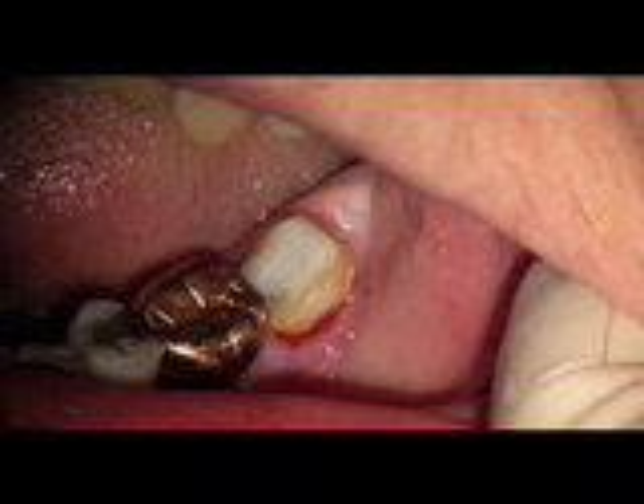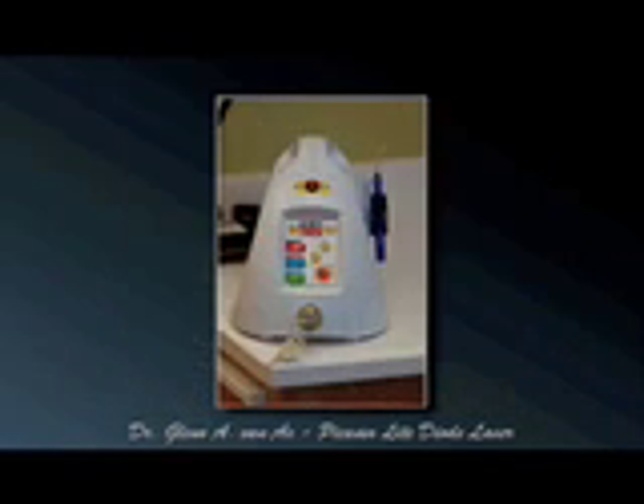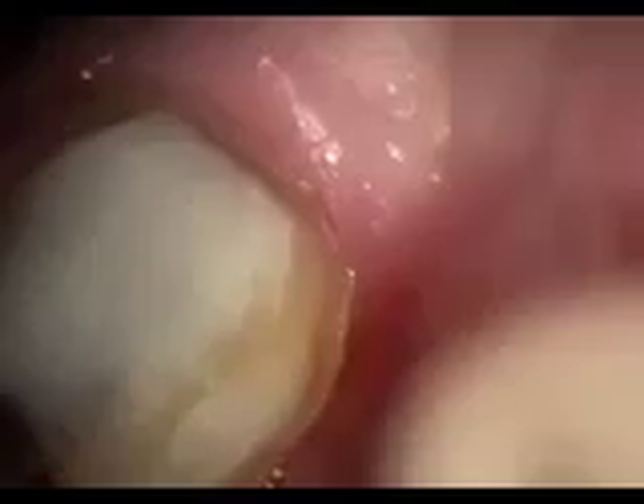At this point we're going to use a Picasso light, which comes in a carrying case box. As you open it you can see all the contents in the box. We're going to use Picasso light in comfort mode, which is the blue setting with the smiling face, at 1.8 watts, 30 microseconds pulse and 30 microseconds duration.